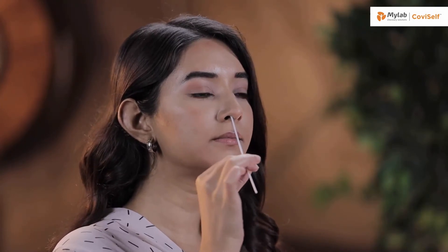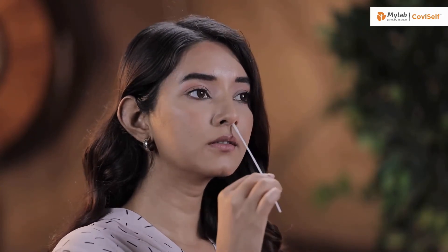Carefully insert the sterile nasal swab in both your nostrils, one after the other, up to 2-4 cm or until resistance is met. Roll the swab five times inside each nostril. Your nasal swab is now ready for the test.